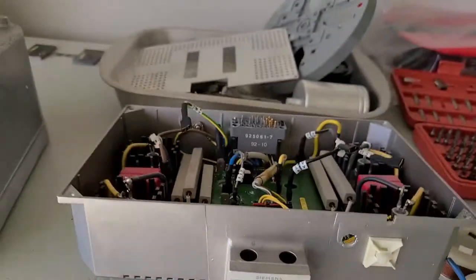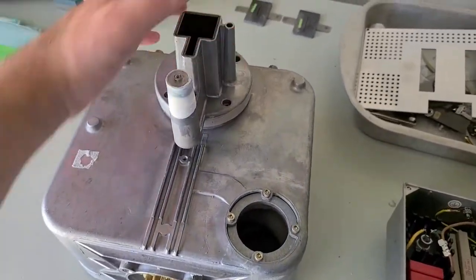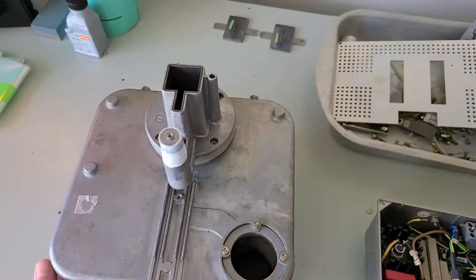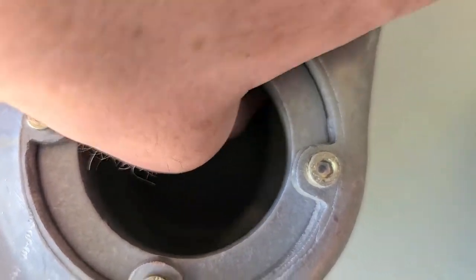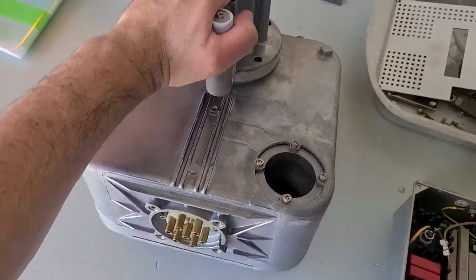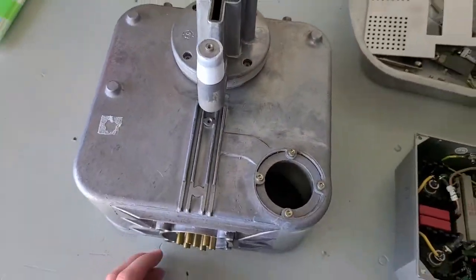Alright, so I got the control panel off here. So basically all that's left now is the tube housing. I'm going to go ahead and, you know, drain the oil and get the x-ray tube out of it. There is a pretty small bellows tube here to allow for expansion. It's like a rubber material and it moves around. That's just because when the oil gets hot, it's going to expand and you don't want to over-pressurize the case. But yeah, that should be pretty simple to take apart and get the oil out.